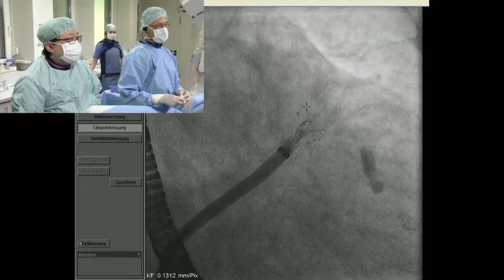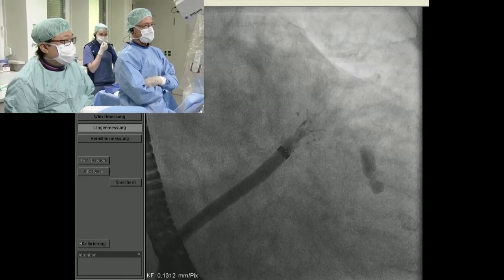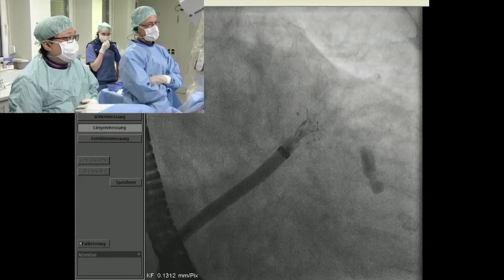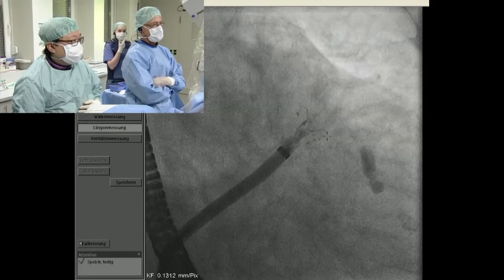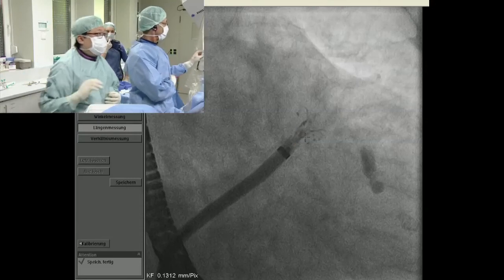While you're doing that, the most important thing is this radio-opaque mark here that connects the upper part. This part is the umbrella, and it's very difficult to move, and this part is the disc. If the umbrella is fully opened, it will roll like this, it will claw, and then it goes down, and the radio-opaque mark here will be at the same level as here. Okay, now show us the current view.